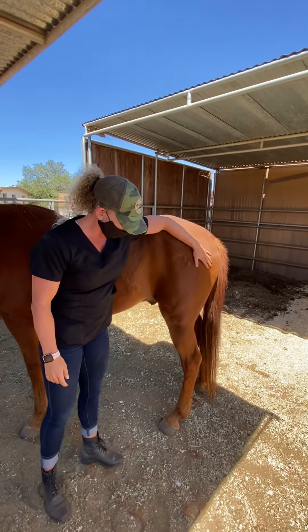I'm going to have somebody remove the cap for me. When giving an IM injection, remember you're going perpendicular into the muscle. I'll scratch him, grab a little area of skin, poke, aspirate back, make sure there's no blood in there, give it, rub it out, and you're good. Good boy, Shia!